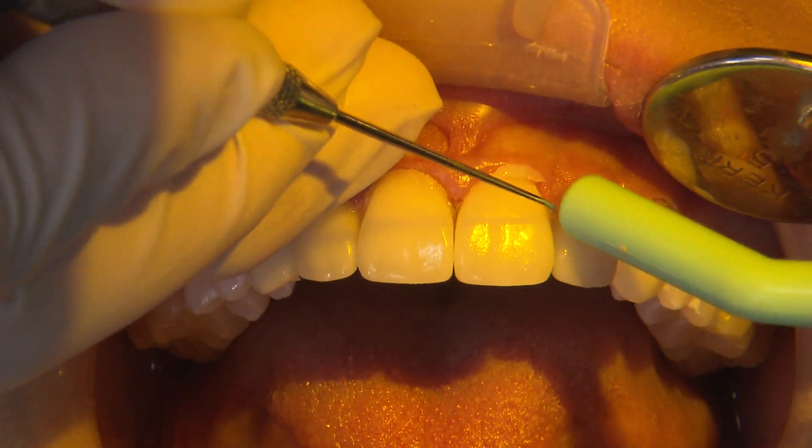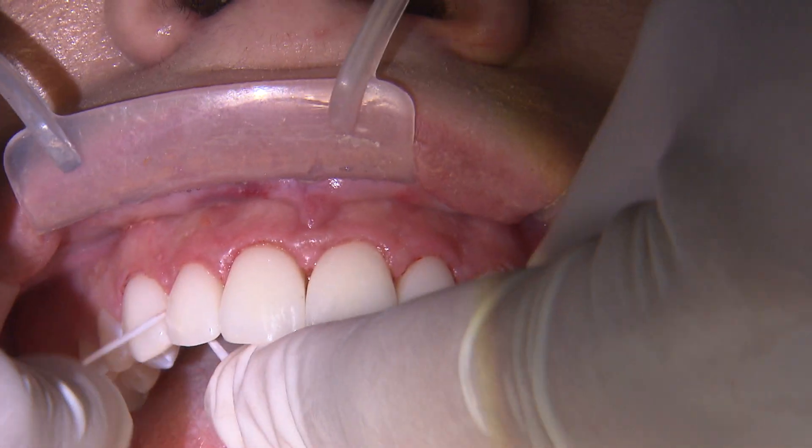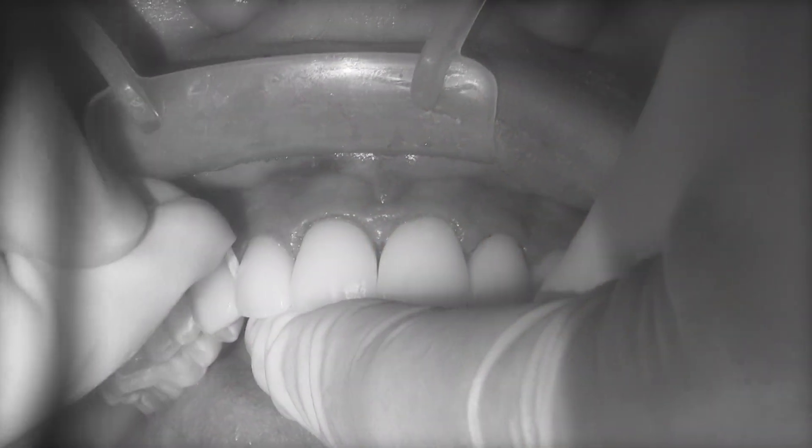After tack curing, I remove as much excess cement as possible with a scaler and explorer, and then floss through the contact areas before the final cure.